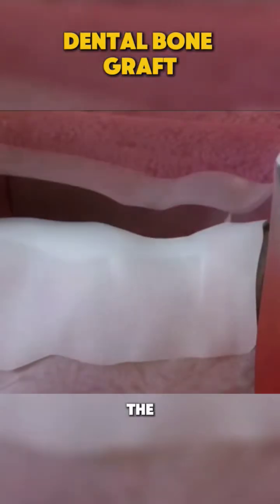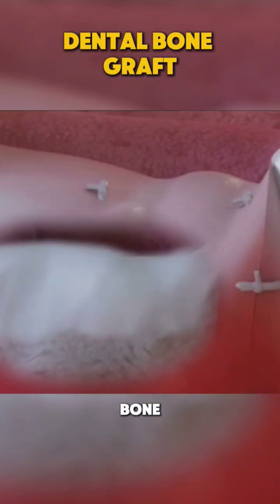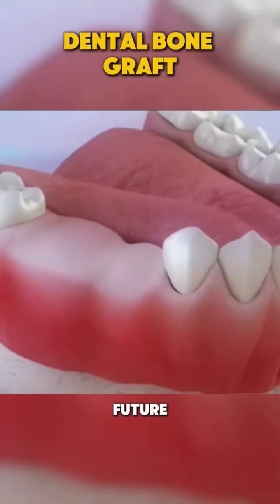The dentist stitches the gums closed over the graft. Over the next few months, the bone graft integrates with your natural bone, building a strong foundation for future dental work.